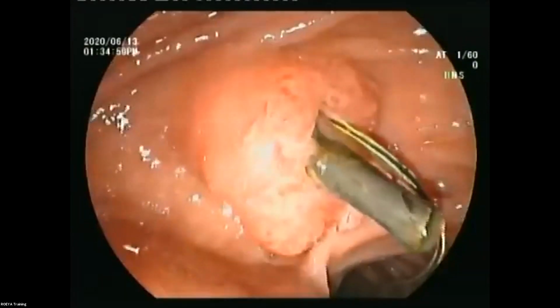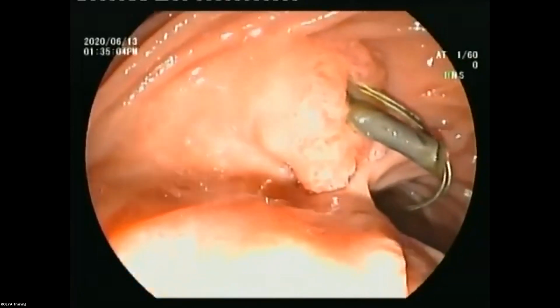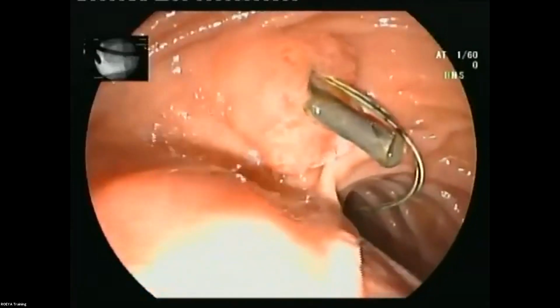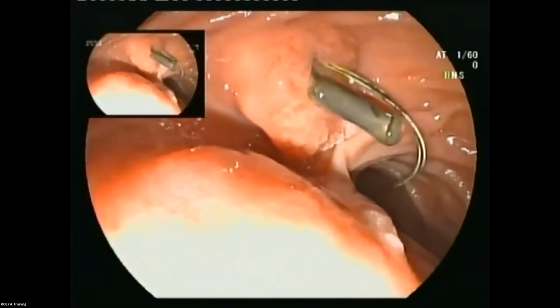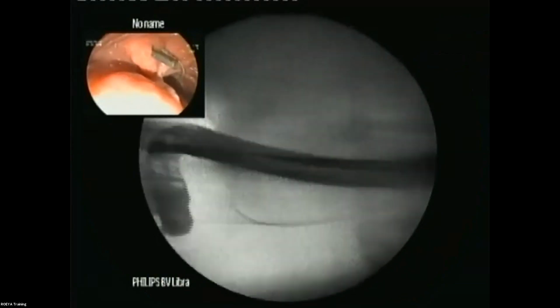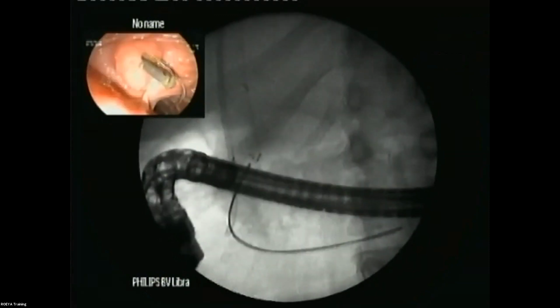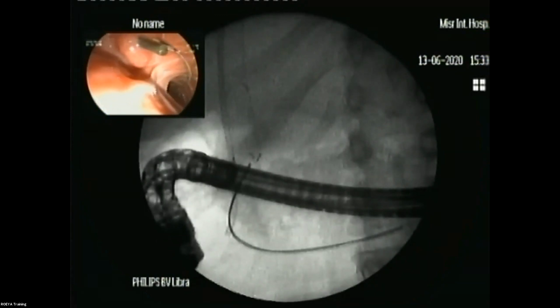All right, so this is my patient. She had a major post-cholecystectomy complication. X-ray, please. Hani, can you show us the endoscopic picture? Could you show the endoscopic picture, please? What is it coming from the common bile duct?